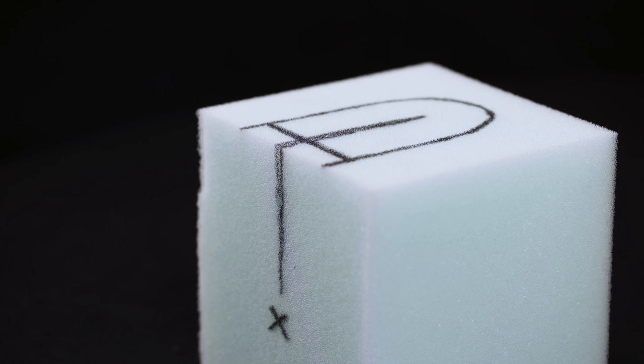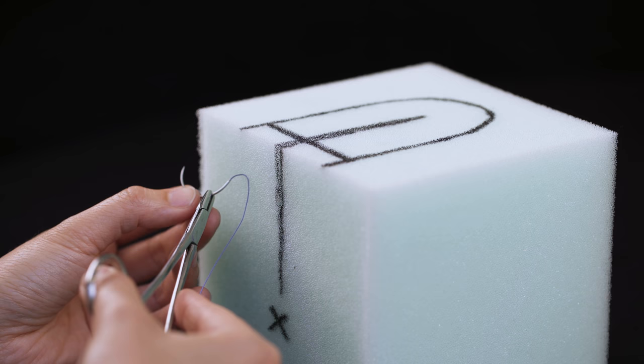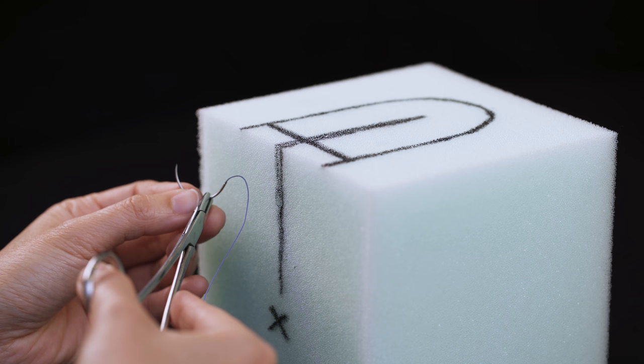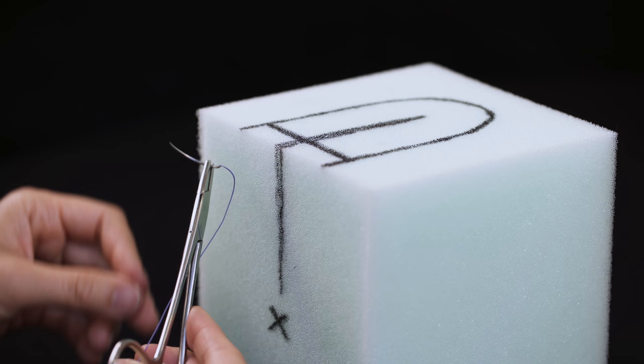Let's load the needle now. I prefer grasping the needle two-thirds to three-quarters of the way down from the tip of the needle. The closer you grasp to the tip, the more control of the needle you'll have, but you'll have less needle space to work with. I also like to angle the needle a bit past perpendicular to the axis of the needle driver. This gives me a more ergonomic position in my wrist and arm.